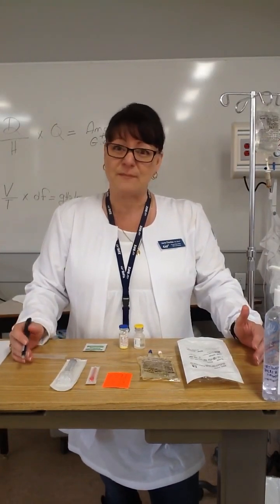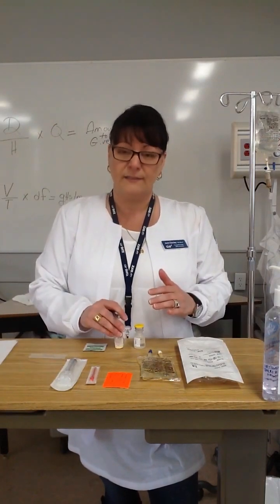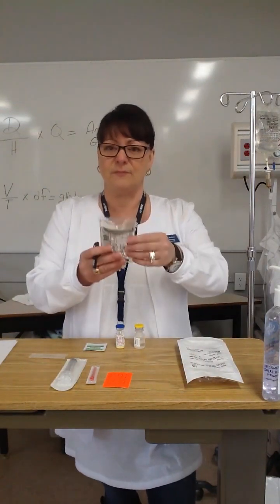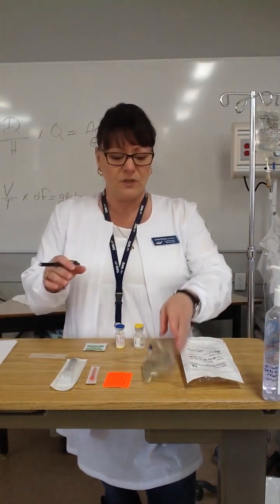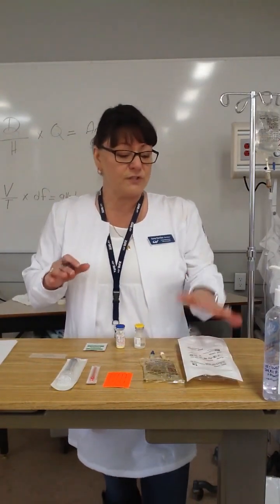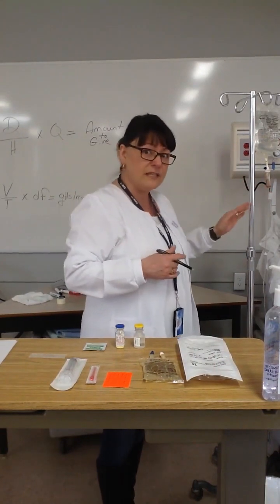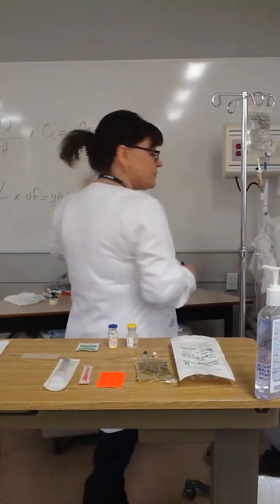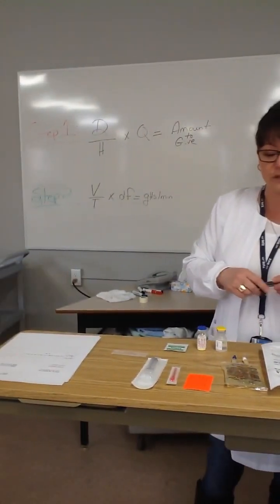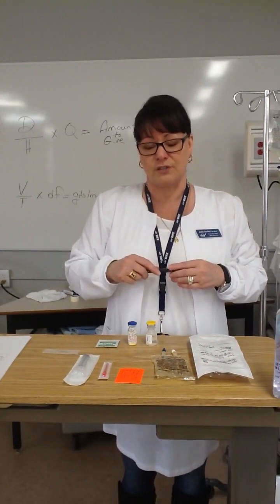Today I'm going to show you a demonstration of reconstitution of a powdered antibiotic, and then we're going to further dilute it in a 50 ml bag of normal saline. We're going to spike that to a 32-inch secondary set, and we're going to attach it to an already existing primary setup. This is a gravity feed, and I'm going to show you the two formulas that go along with this demonstration for successful, safe, competent preparation and administration of this medication.